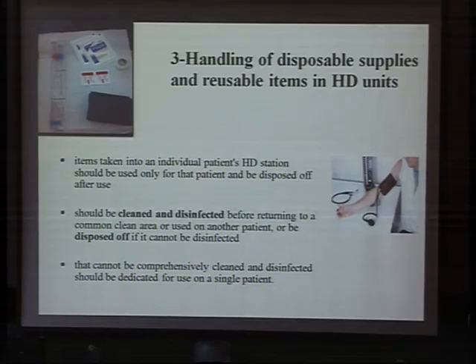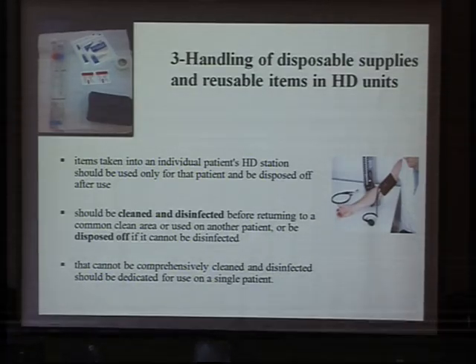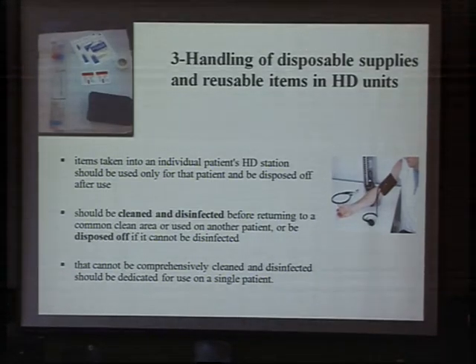What about handling of disposable supplies? Very important point. The station of the hemodialysis patient is his own. All the equipment used is for him. Don't move it to another patient. If unused, return it to the nurse station after sterilization or disinfection. If it cannot be disinfected, it should be disposed of.